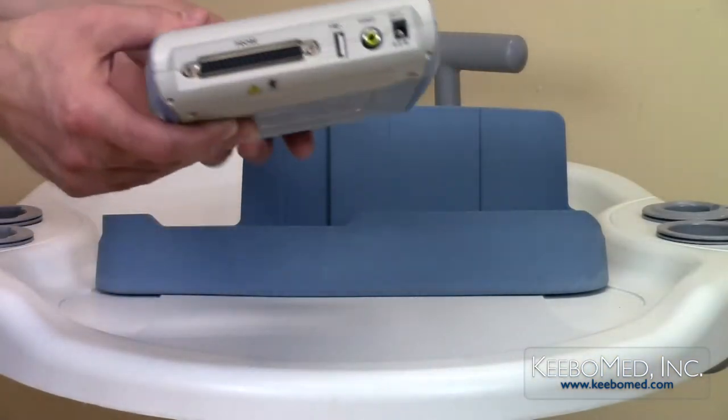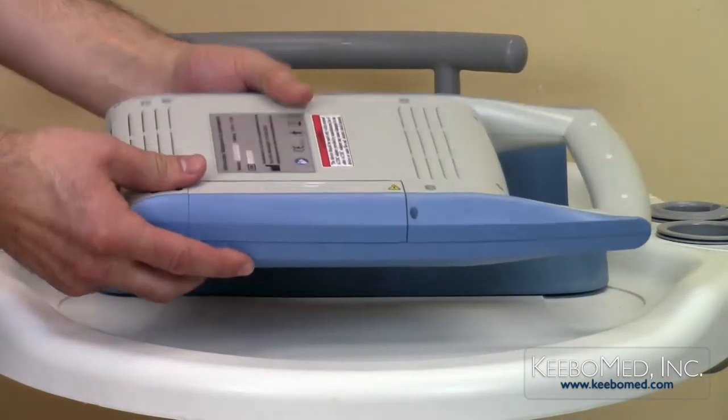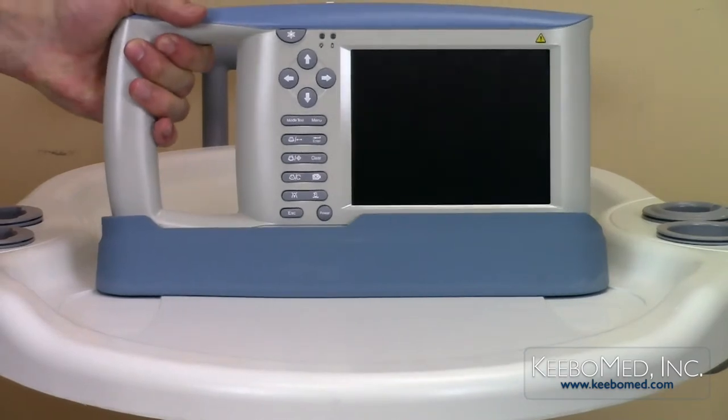The KX5100KV weighs only about 3 pounds. It is battery operated and includes two batteries. Other brands such as the WED3000 and 3100 only include one battery. A power adapter is also included.